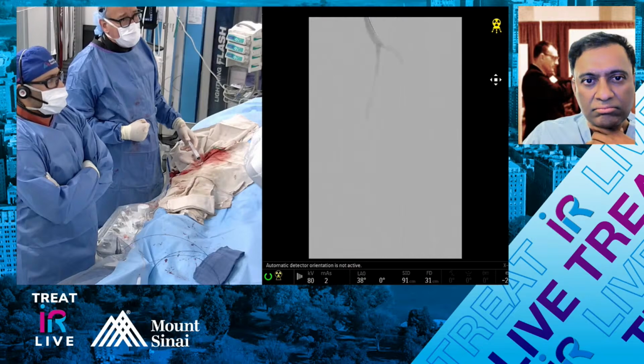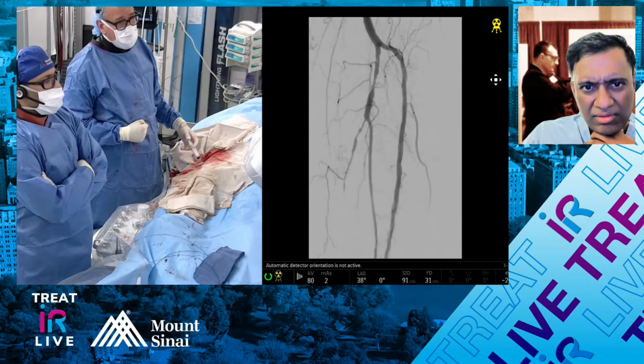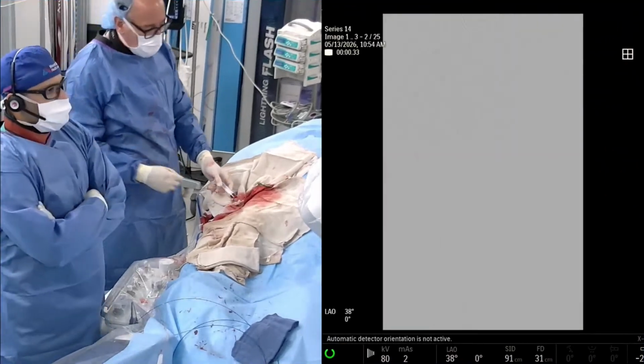But it's really symptoms. See, that segment looks so much better now. All right, so that mid segment that had that collapsed area, that's well treated.